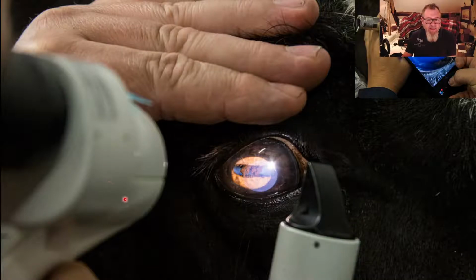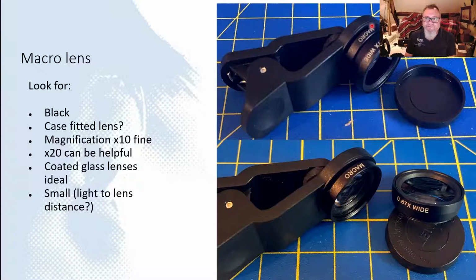We use a slit-lamp, which is a handheld microscope with an oblique light source, and we can look at high magnification structures in the eye from the front of the cornea to the anterior vitreous. We can mimic this technique using our smartphones with a little macro lens attached in front of the lens and either an oblique light source using a pen torch or the on-camera light.